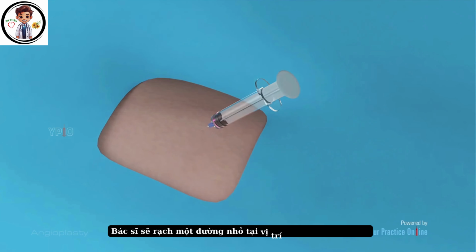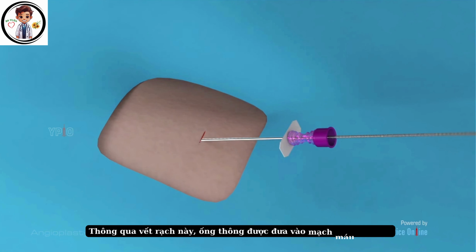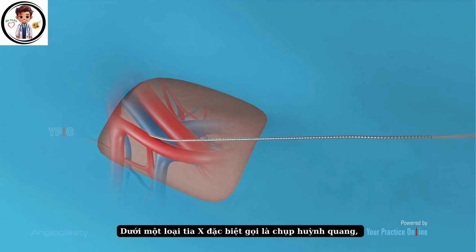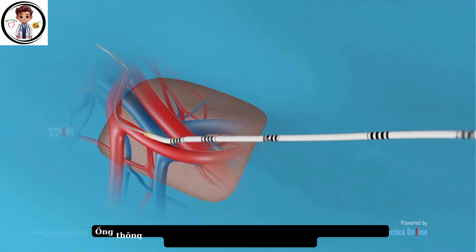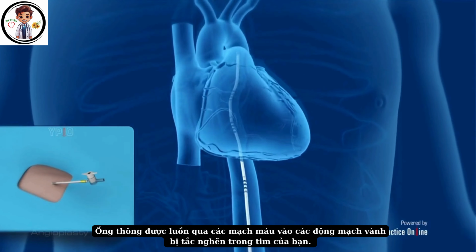Your doctor will make a tiny cut at the insertion site. Through this incision, the catheter is inserted into your blood vessel. Under a special type of X-ray called fluoroscopic imaging, the catheter is threaded through the blood vessels into the blocked coronary arteries in your heart.